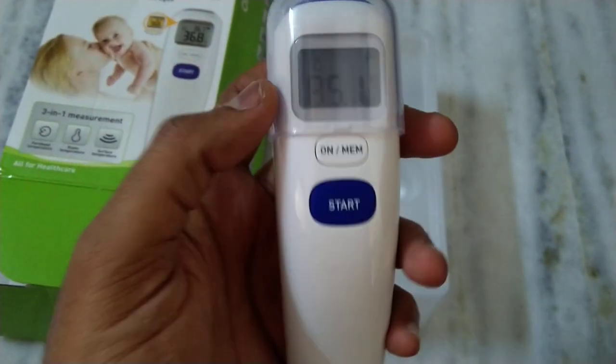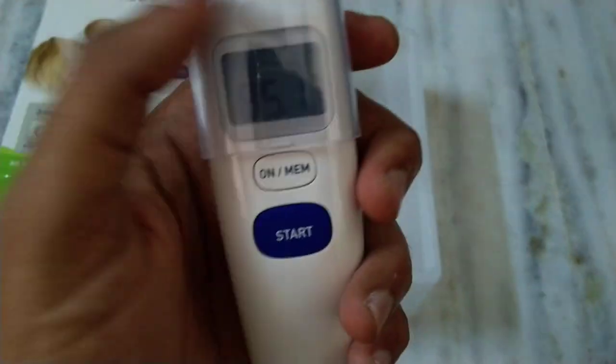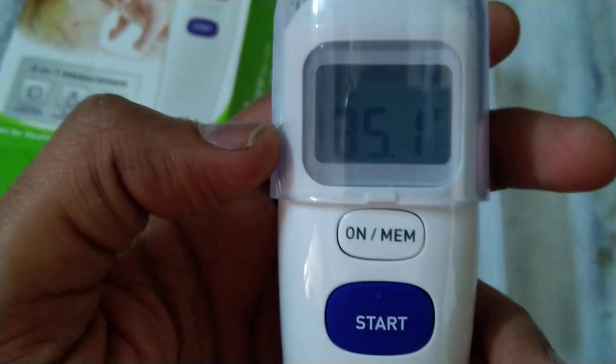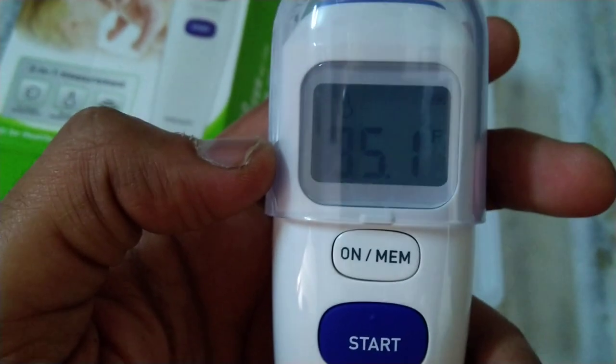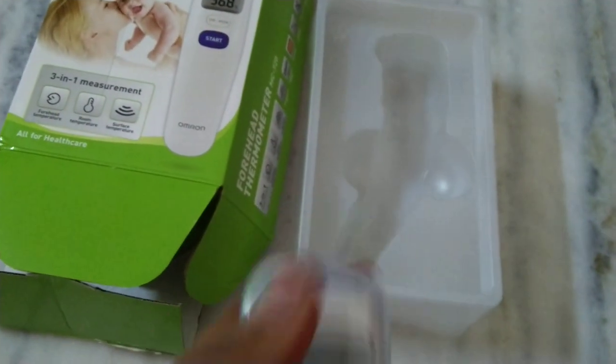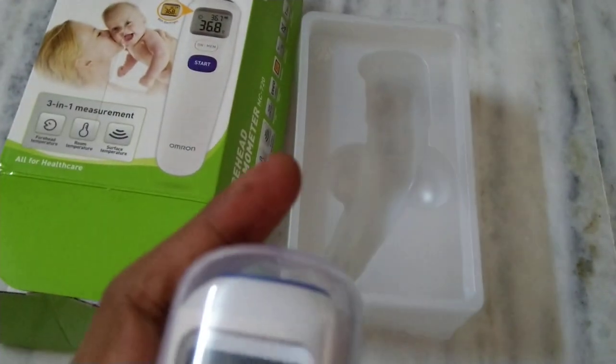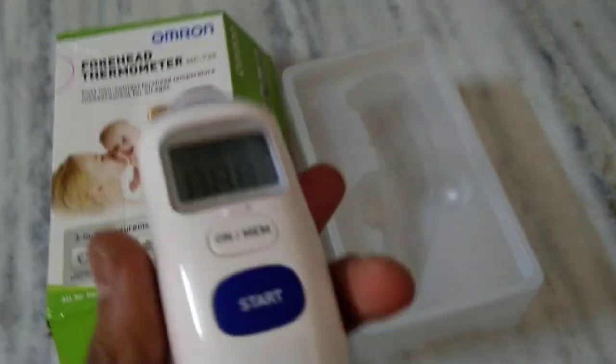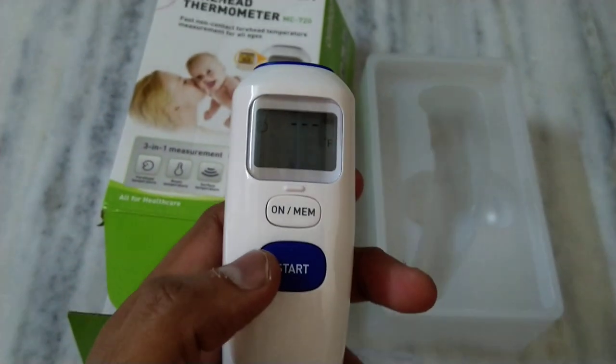This is the cover, and you can see the display here. Right now it's showing room temperature — 35.1 degrees Celsius. When it's in idle position it will show you the room temperature.